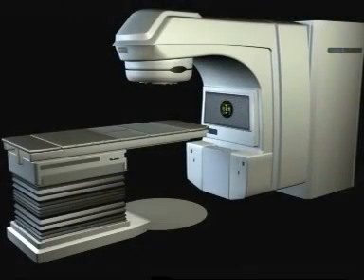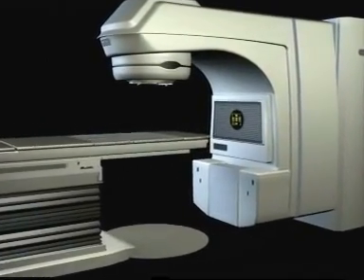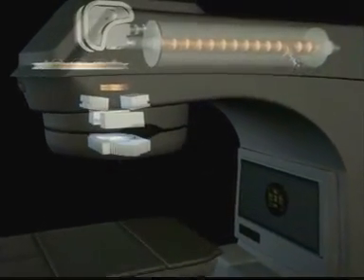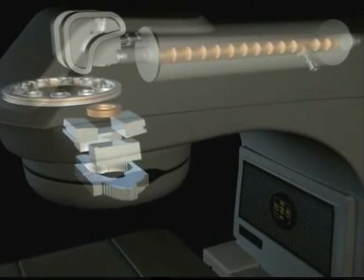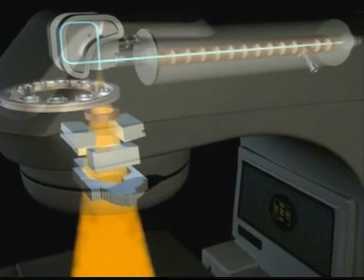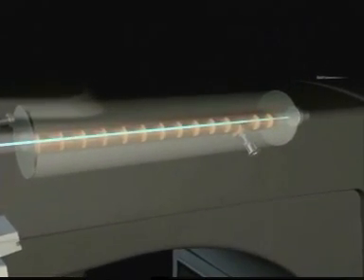Smart Beam IMRT treatments are clinically delivered by a Varian Clinac, a fully computerized medical linear accelerator. The unique design of this machine permits a highly accurate delivery of desired dose distributions to the tumor while minimizing the amount of dose to critical organs and surrounding healthy tissue.